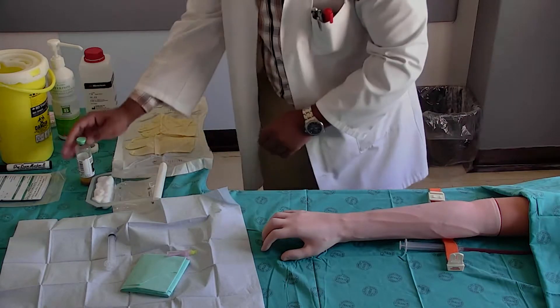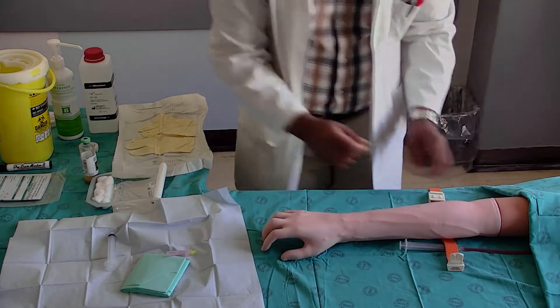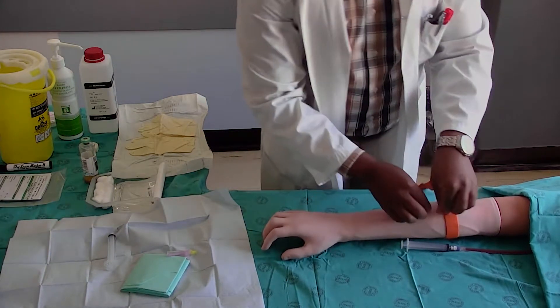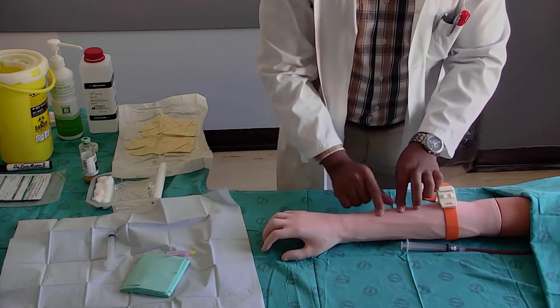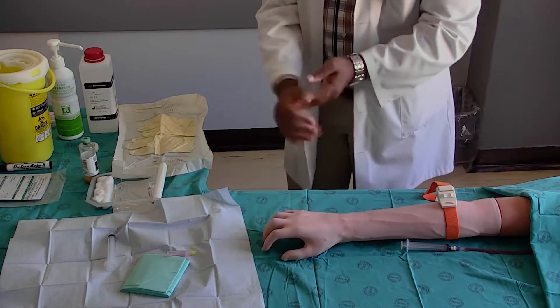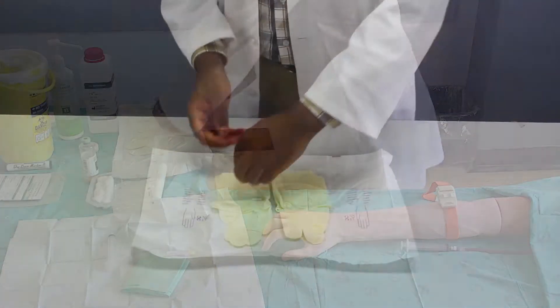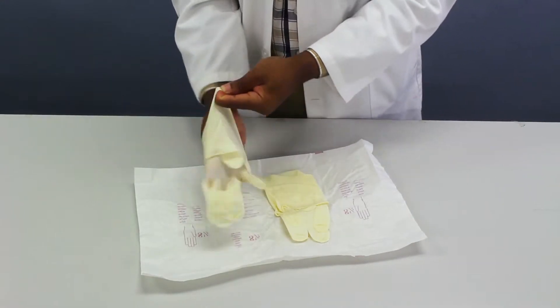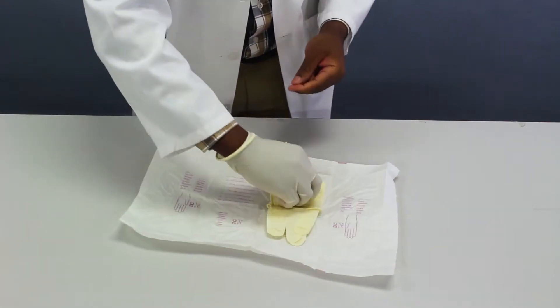Flip the lid off the blood culture bottle. Apply the tourniquet four to five fingers proximal to the venipuncture site. Palpate a suitable vein to be used to draw blood from. Disinfect your hands with alcohol disinfectant and let them dry. Apply sterile gloves using aseptic principles. Do not re-palpate the vein once gloves are on.